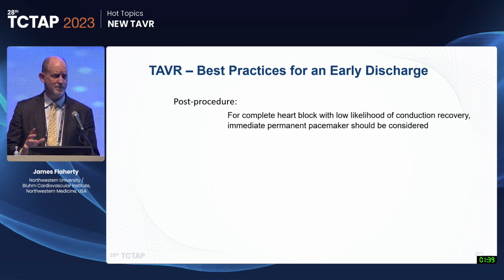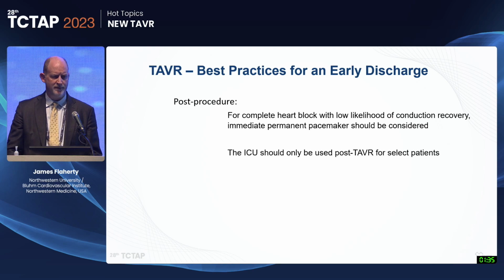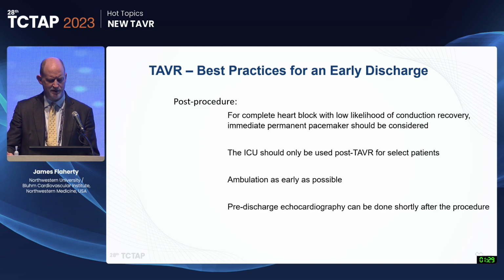Post-procedure, if they have complete heart block that you don't think there's recovery, just put the pacemaker in the same day. Patients rarely should go to the ICU anymore. They should go to a tele or a step-down bed. Ambulate as early as possible.